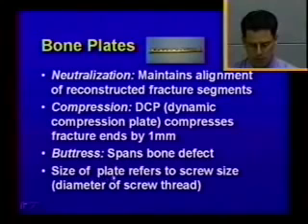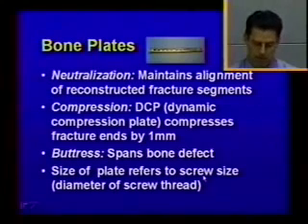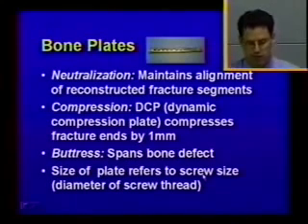The size of the bone plate refers to the screw size, and a screw size, such as a 3.5 millimeter screw, refers to the diameter of the threads of the screw. So when plates are named for their size, it refers to the thread diameter of the screws that are to be used with that plate.